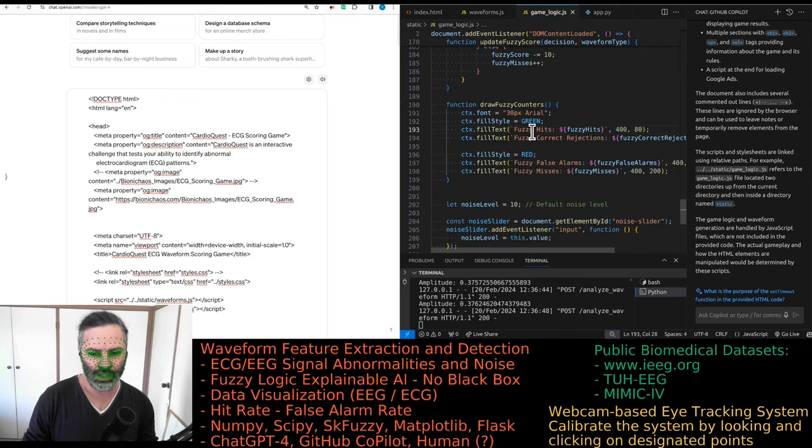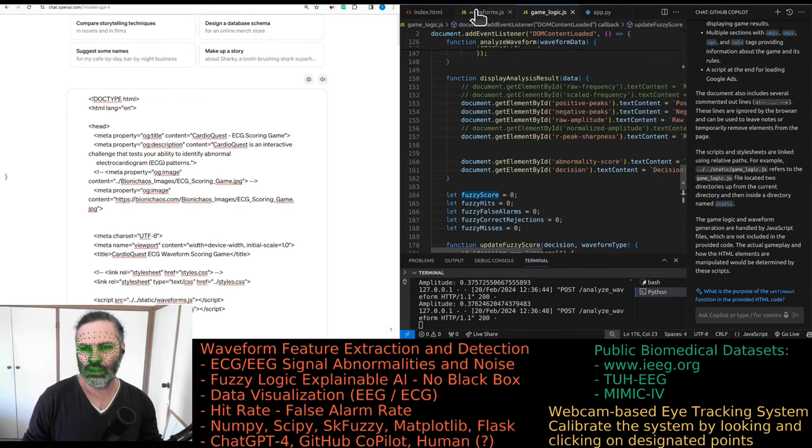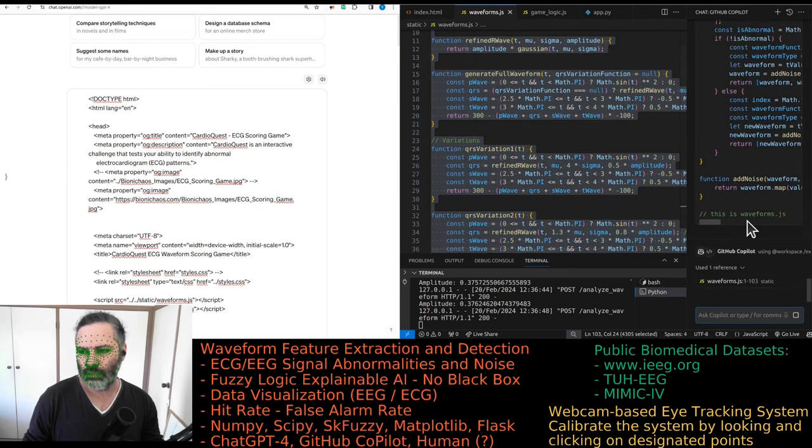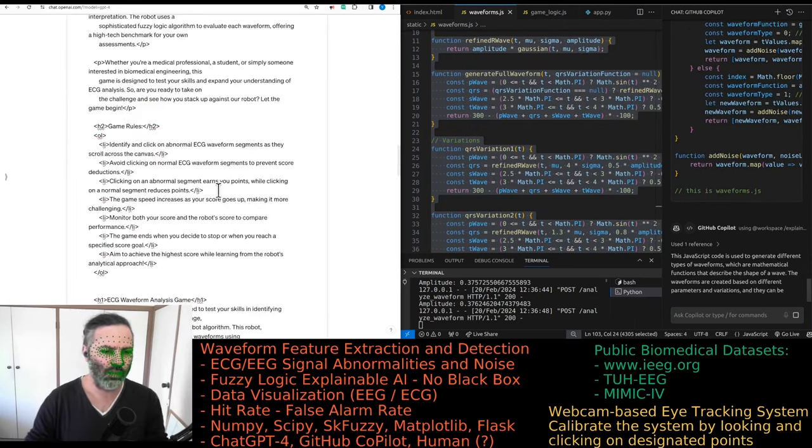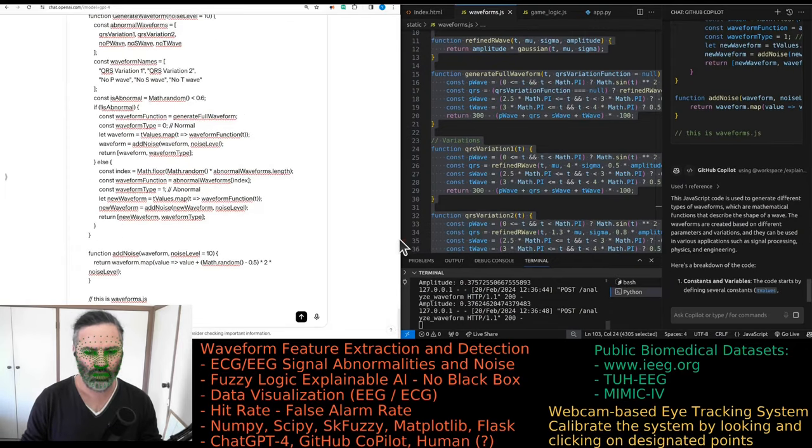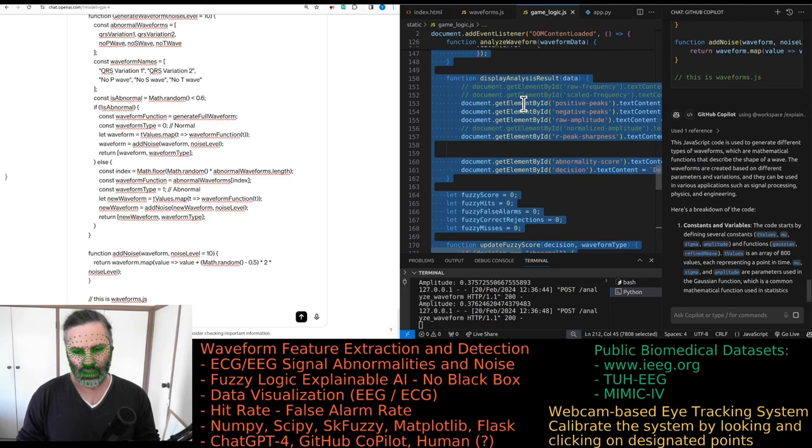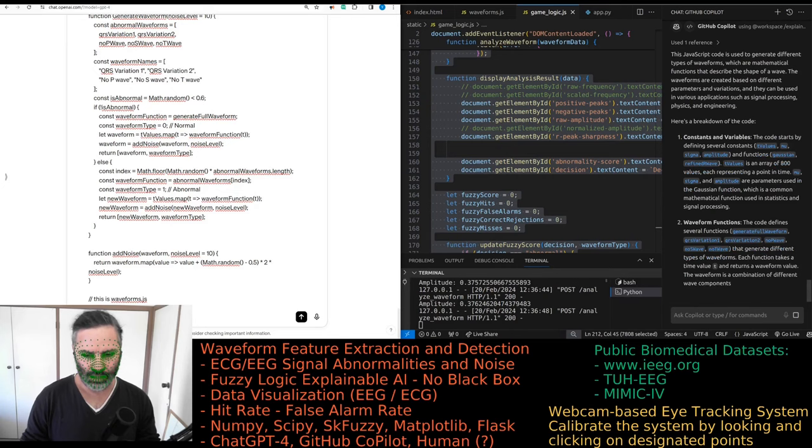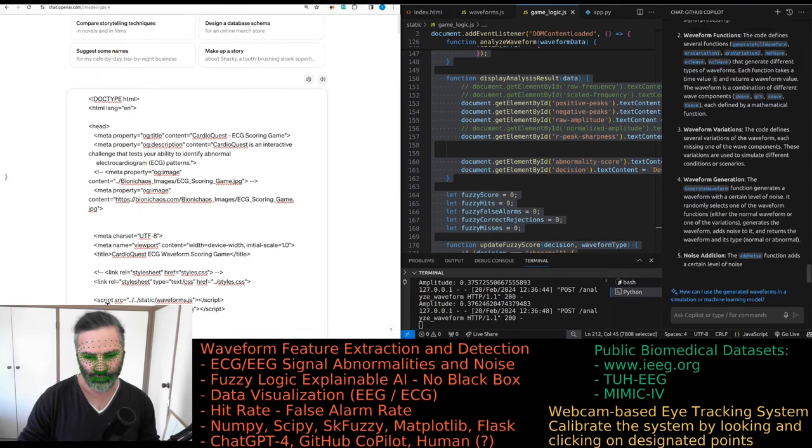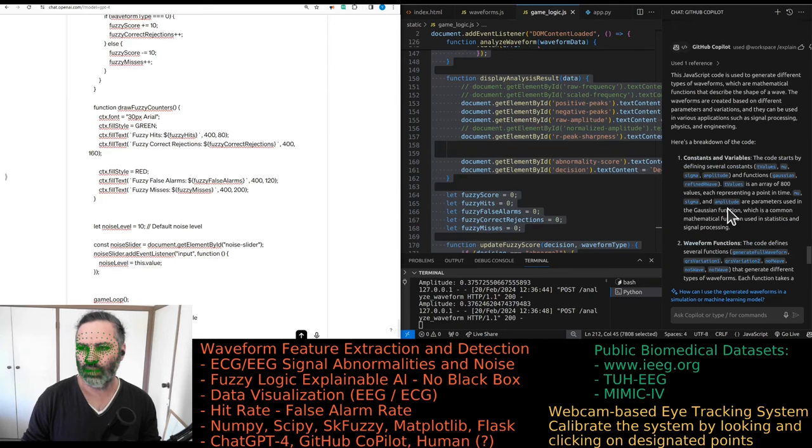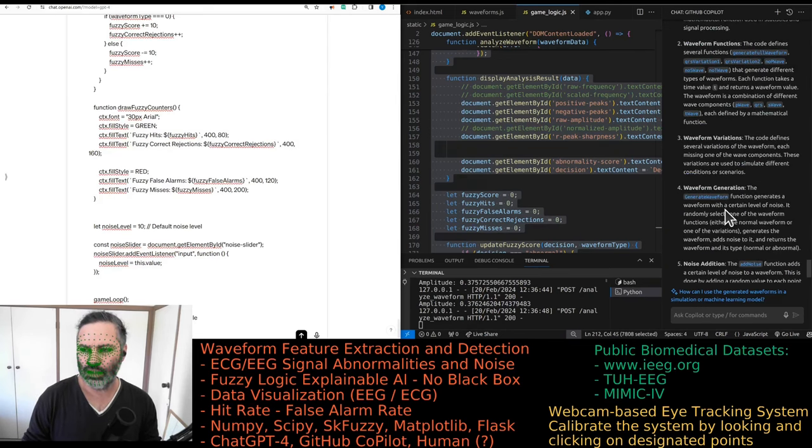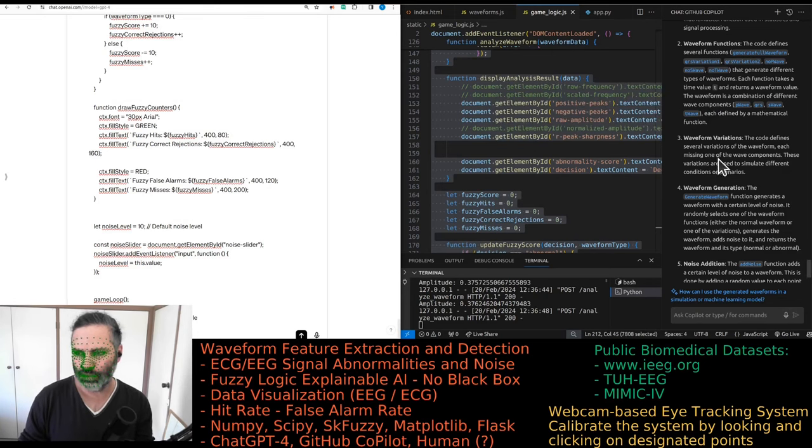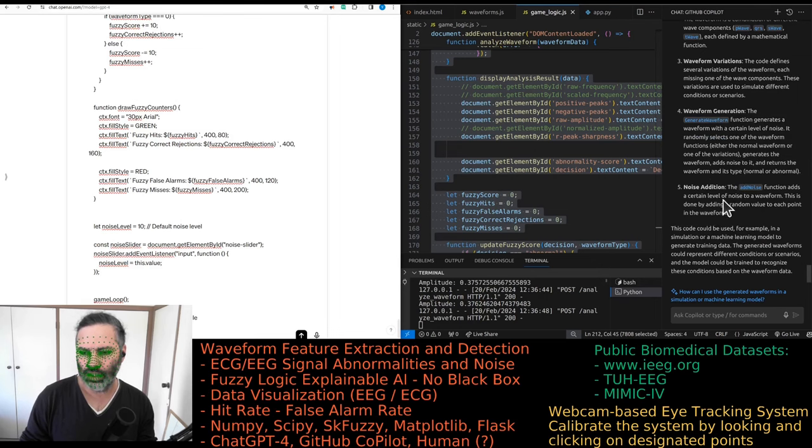Now we have this game logic. We might as well get the Copilot to work just by explaining the code quickly. We'll try this one-shot prompt because it tends to work better to begin with and then performance drops with consecutive prompts. We do constants, waveform functions, variations, generation and noise addition.